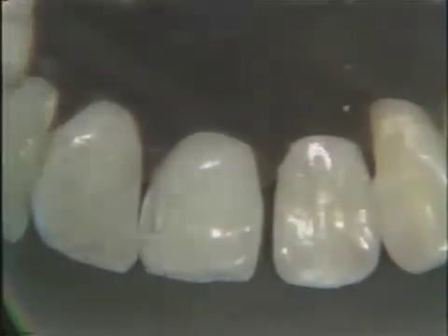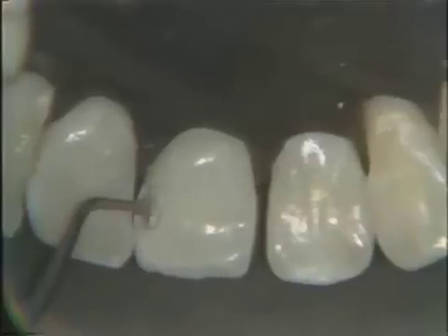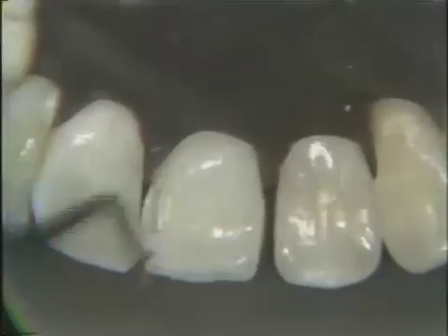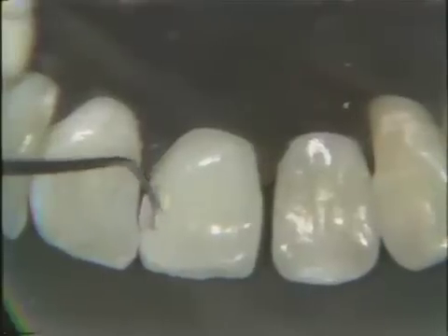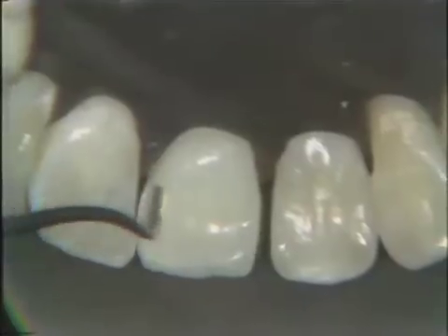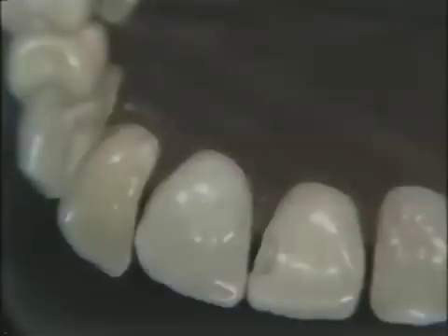Not on any enamel. If you notice it, like there was a little piece on the enamel wall, just go back in with your instrument and pop it out. And keep it out of your retentive groove also. If you look closely, you can see the retentive groove in the labial, where we're pointing, is very clean. And out the incisal now he shows, there was a spot. So out it comes. So take your explorer and just check. Now in the cervical, maybe a tiny spot, but not much. Notice the contour of it. It is not built out to replace the lost dentin.